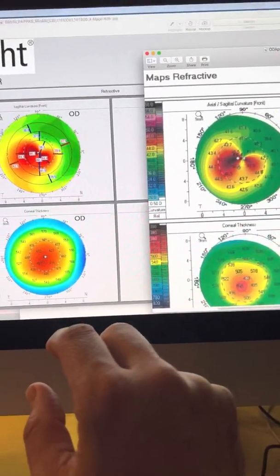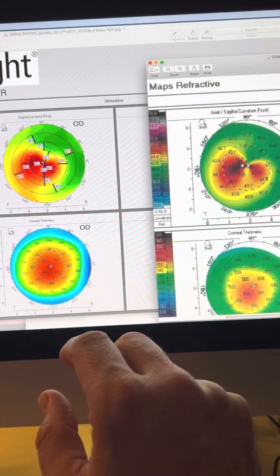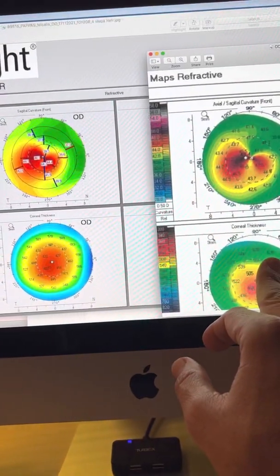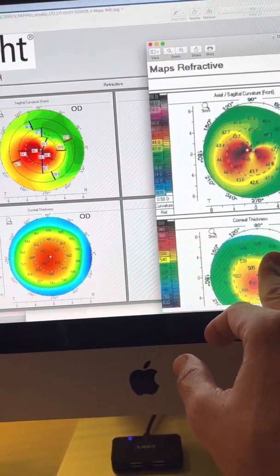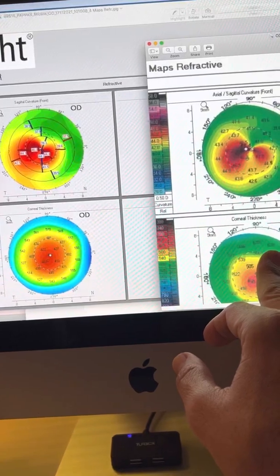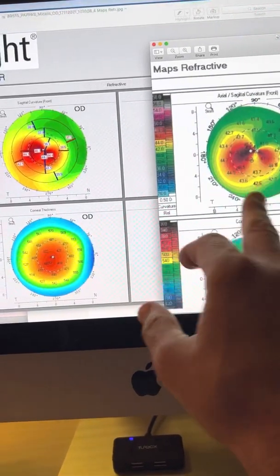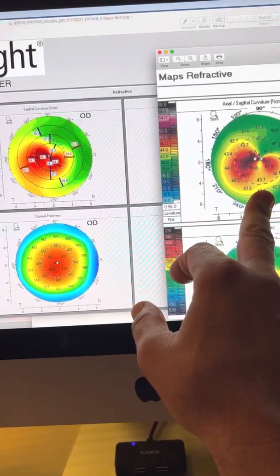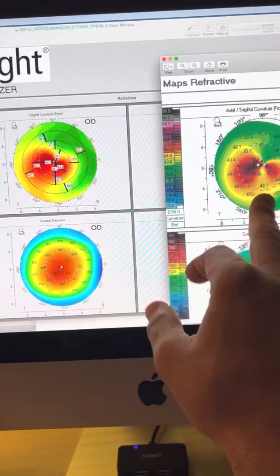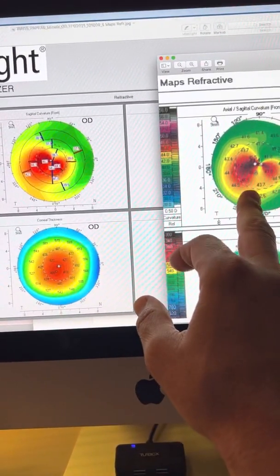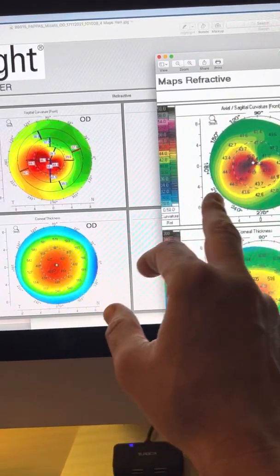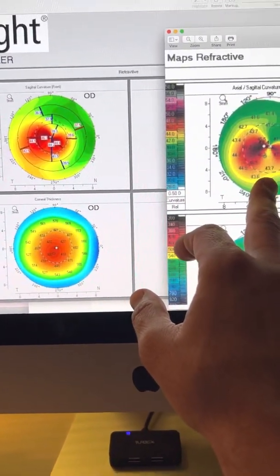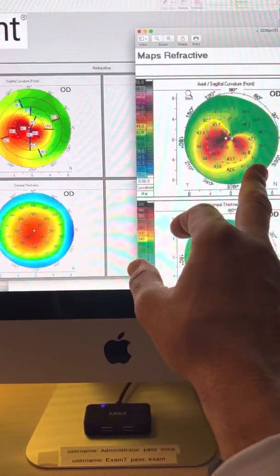So we don't have the ability of comparing this Athens Protocol case, because this was done elsewhere in a center here in Athens. But we can tell that this is a very minimal correction of the irregularity of the cornea. We invariably see far more significant correction of the irregularity of the cone.